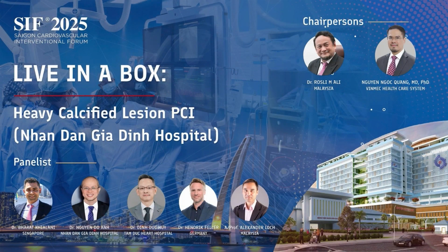Thank you, the Nyanzadik team, for the great case. However, we need more comments and suggestions from the panelists. Should we stop with the dissection of the left main like that?